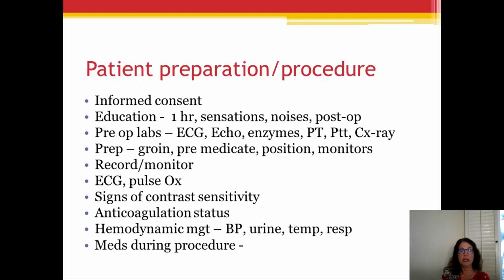Pre-op labs, certainly EKG, echo, baseline enzymes, what's their clotting studies, do we have a baseline x-ray so we know what we're going in with. Generally you're prepping some area, lots of times it's the groin, and then pre-medicating the patient before they go in, certainly positioning them comfortably, and everything's monitored. We've got an EKG, we've got a pulse ox, we're monitoring everything during the process.